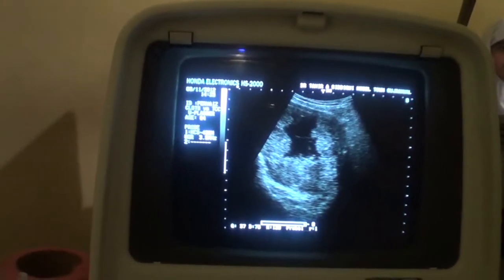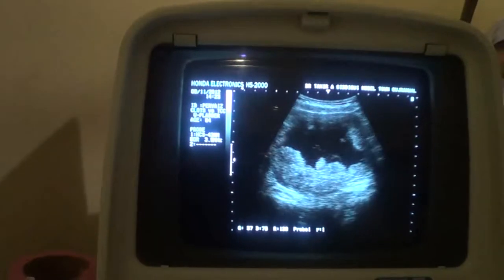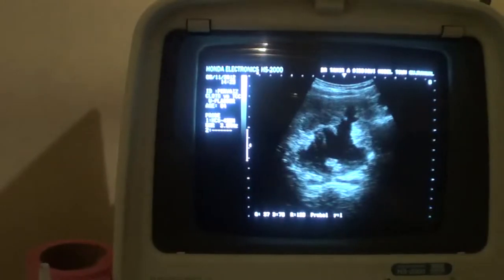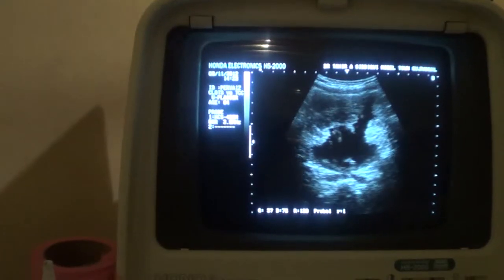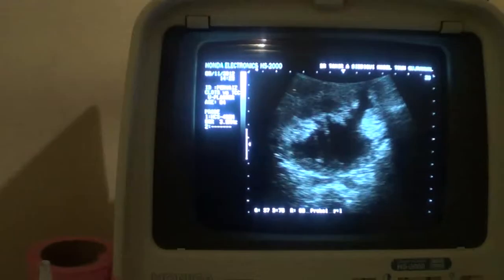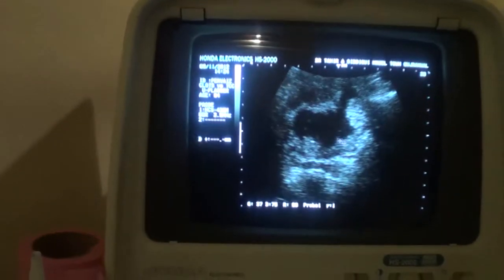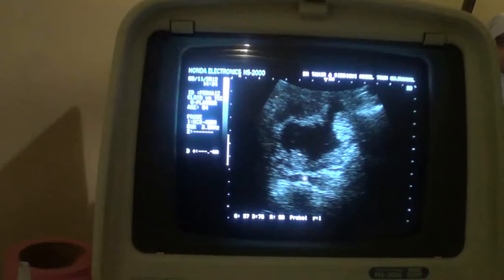However, we must advise the CT scan to be sure that it is not invading the urinary bladder wall too, as this will change the grading of the pathology if it is a transitional cell carcinoma. If it is a clot, then it doesn't matter. This is the seminal vesicle, and the seminal vesicles are spared. This is the seminal vesicle, and there is no invasion up to the seminal vesicle.